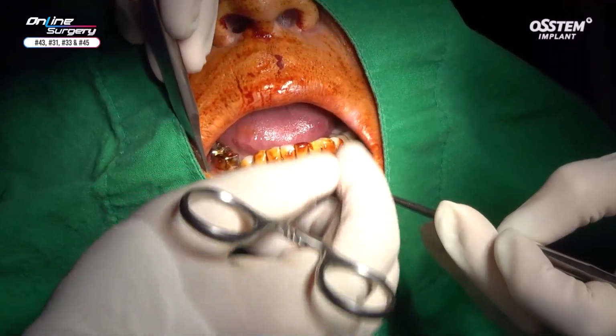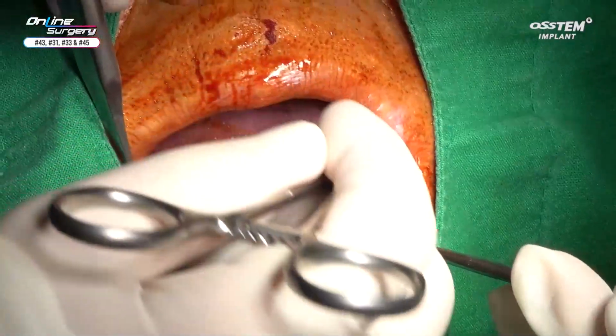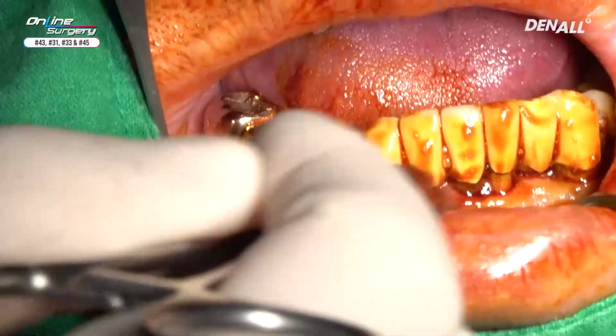There is a 6-unit bridge between canine and canine. Immediate implant placement will be done after removal. There's root rest in number 5. This is going to be addressed next time.